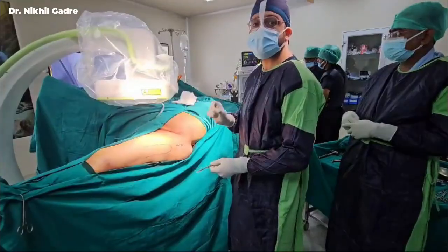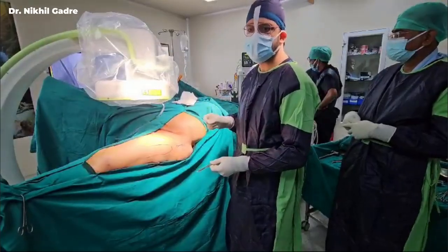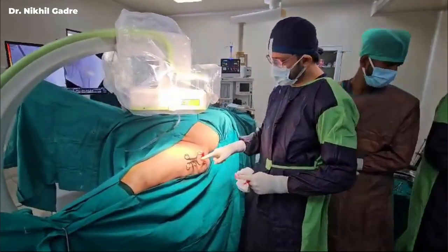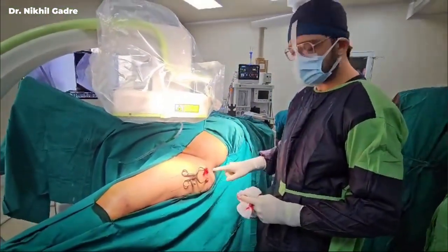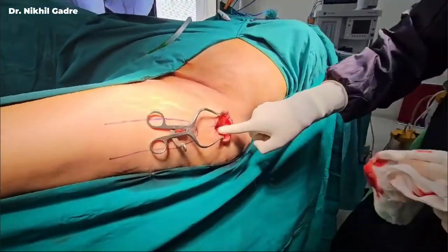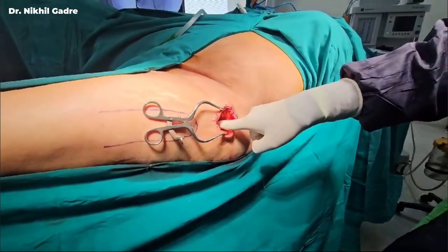Entry is the most important point in any femoral nail, be it an interlock nail or a proximal femoral nail or a trochanteric femoral nail. Entry is the most important. As you can see, we have made the incision. Skin and subcutaneous tissue have been incised, and then we have added the self-retaining retractor. Now we will divide the tensor fascia lata, if you can see, and gain entry into the gluteal muscles.